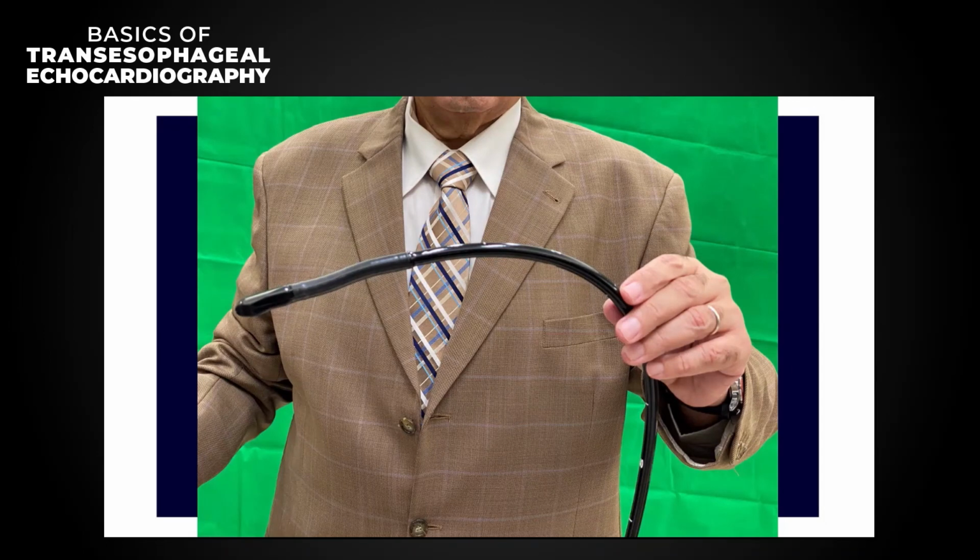within the range that we usually use for prosthetic valves, an INR of 2.5 to 3.5. This is the therapeutic level that we give to people with a mechanical mitral prosthesis or double mechanical valves. So if you are more than 3.5, be cautious during the manipulation. If it is more than 4, I advise to postpone the TEE and go less than this.